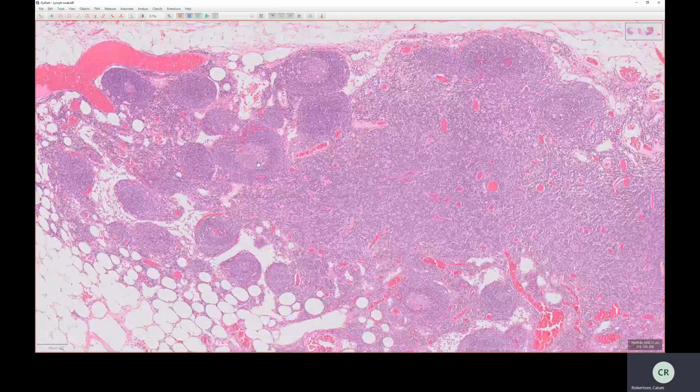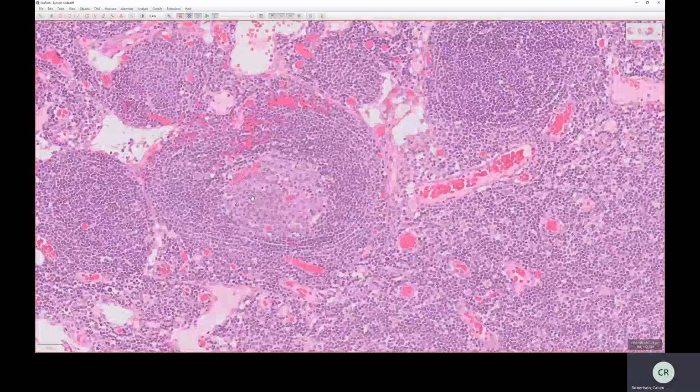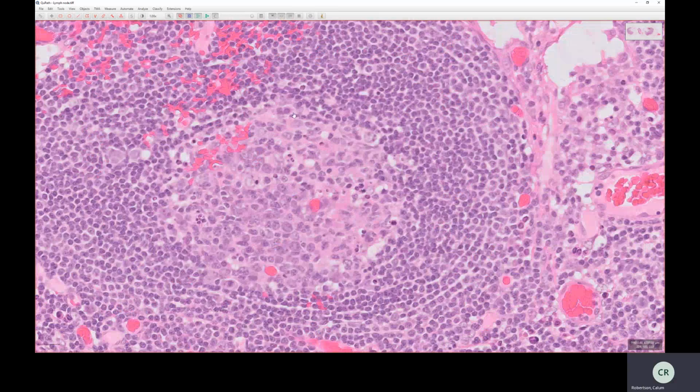And if you start looking around on your own when you see lymph nodes, you might be able to see less subtle examples, but it often can be a wee bit subtle. And that's because there are two main areas here with different cells in them. So as I said, the germinal center is made of activated B lymphoid cells. So within the dark half, we've mostly got centroblasts.